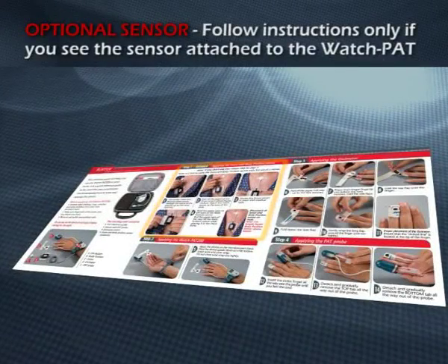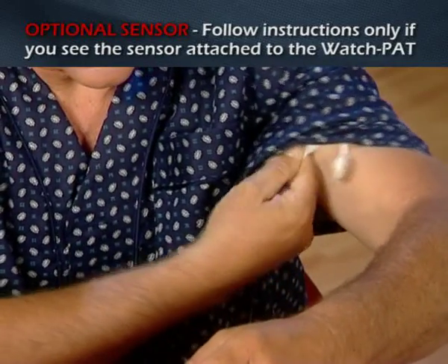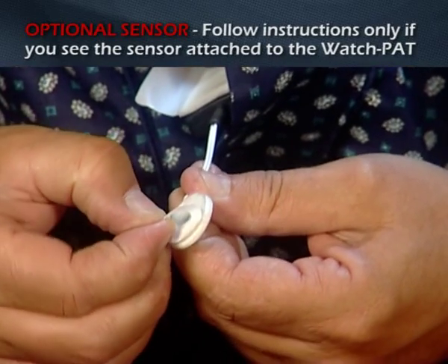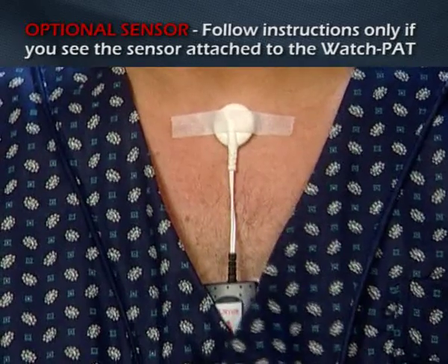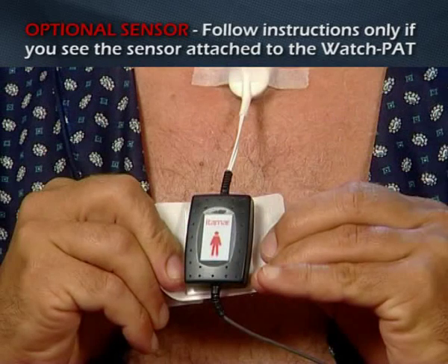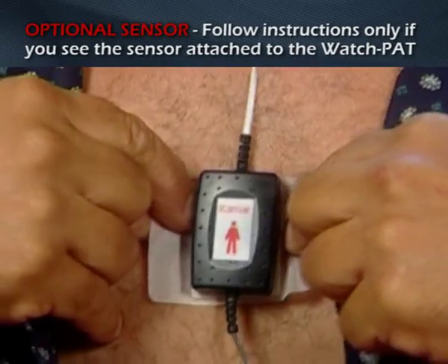Optional step: placement of snore and body position sensor. Thread the cable through the pajama sleeve up to the neck opening. Peel off the small round sticker of the snore sensor and attach it to the base of the neck. Secure the snore sensor in place with medical tape. Hold the paper tabs on the back of the body position sensor and pull them all the way off while placing it on the chest bone.